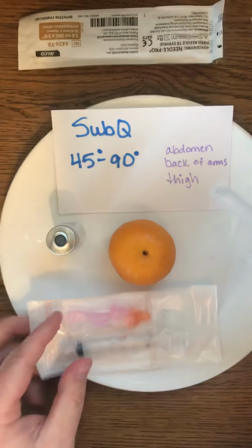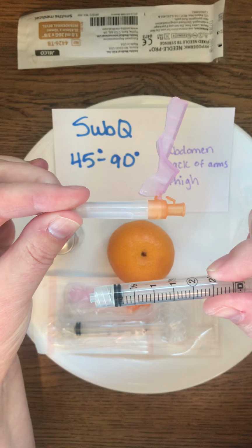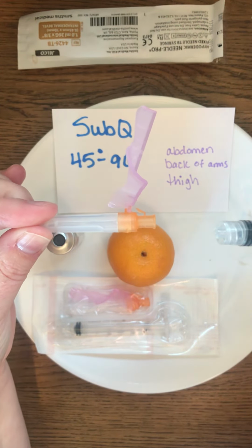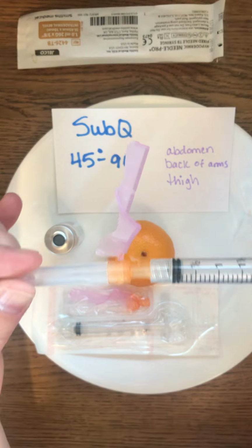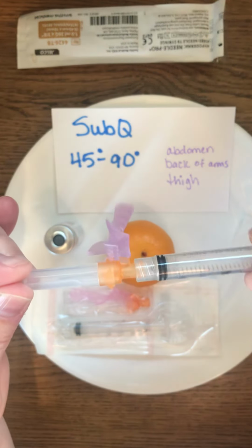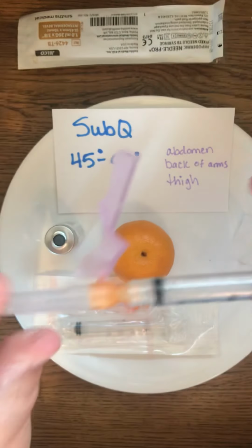So what you want to do, they're going to come apart. They'll be like this. And I'll show you in just a second. But what you want to do is you're going to take out the syringe part. You don't even have to take it all the way out of the package. And right away, while the needle part is still in the package, you want to put them together. So you're going to push. You barely have to push at all. And then you're going to twist on. All right? And then once you have that, then you can pull the whole thing out of the package.